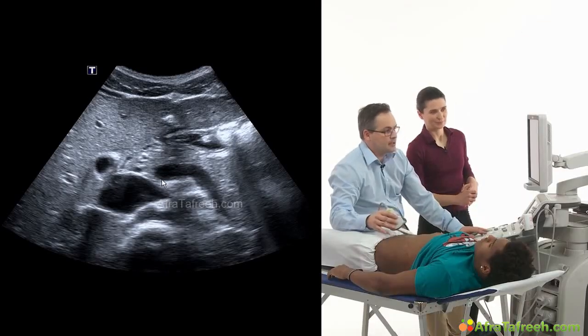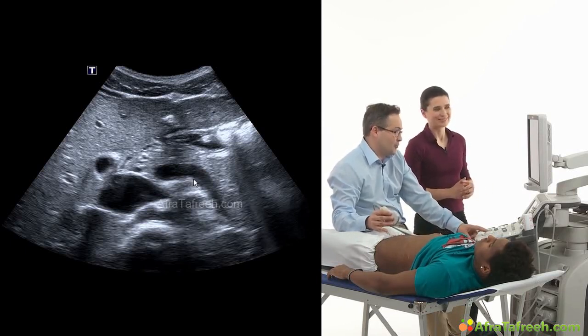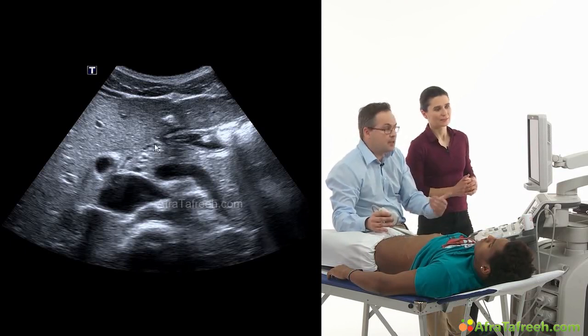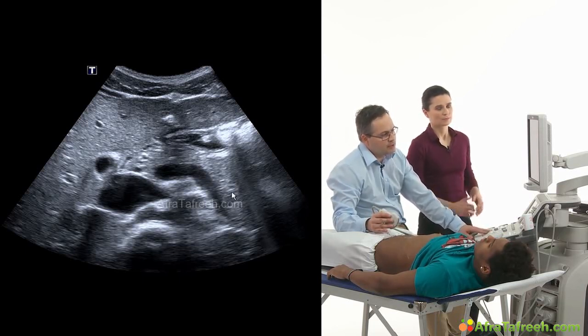So we can detect the splenic vein over here. And I think it looks like a polliwog. Yes, or like a dolphin. Of course. And the whole tissue superficial to the splenic vein is pancreatic tissue. So we can identify the head of the pancreas, the body of the pancreas, in between the neck, and some parts of the tail of the pancreas over here.